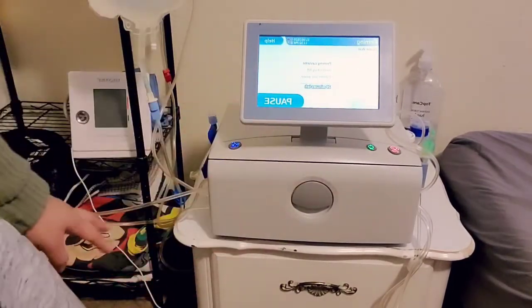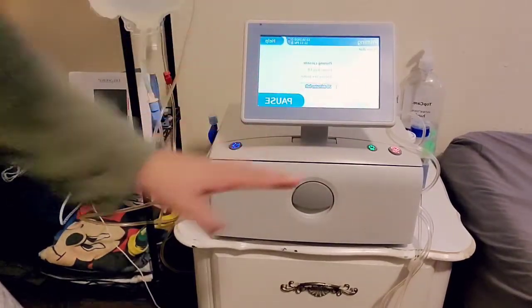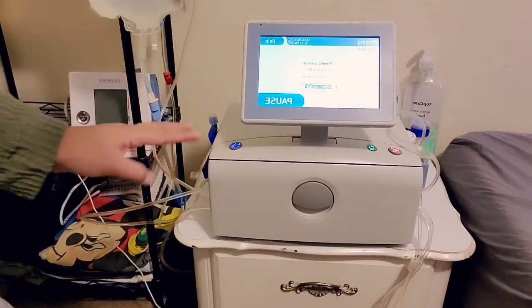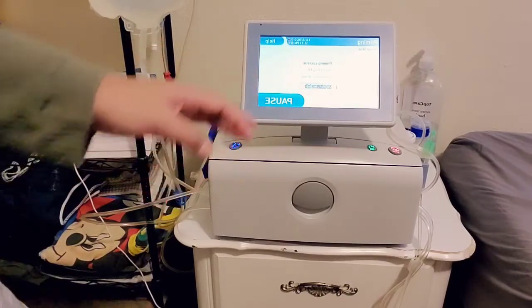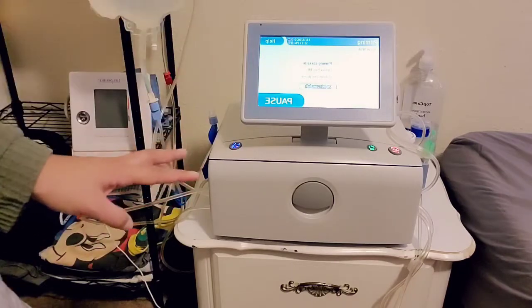Now press prime and it's going to prime the entire solution — it takes about 20 minutes. At this point, grab a snack, watch your show, get ready for bed. You have time to leave this alone.